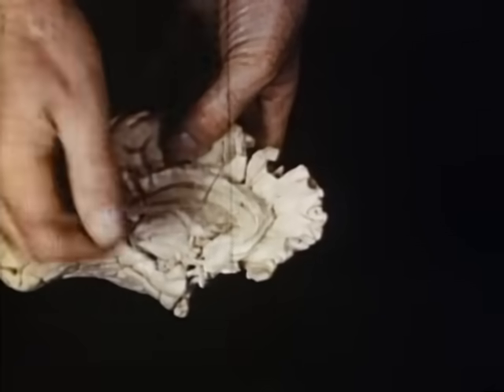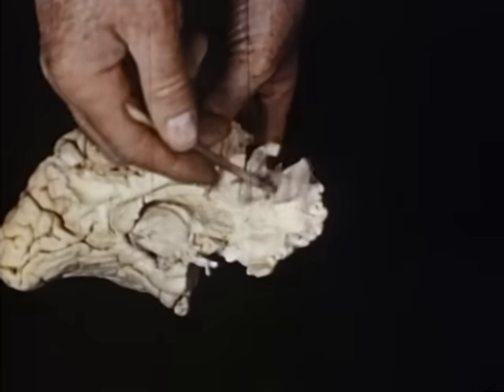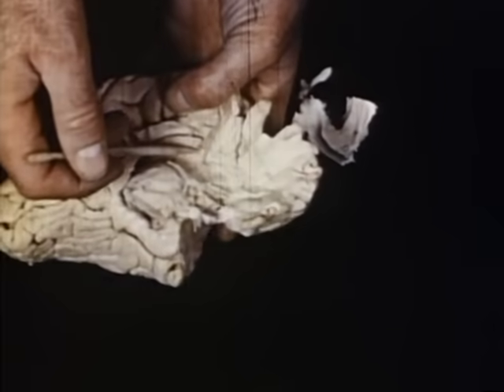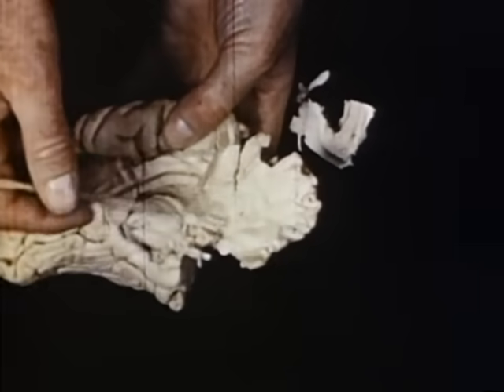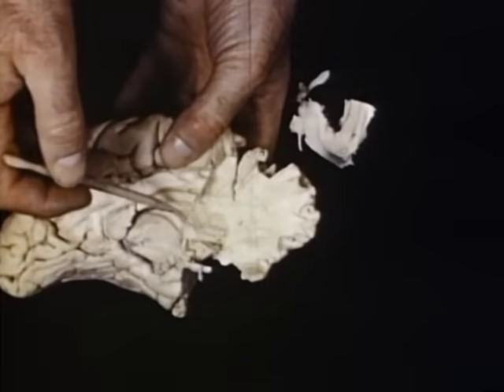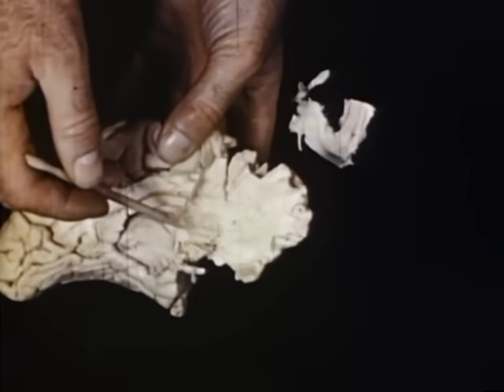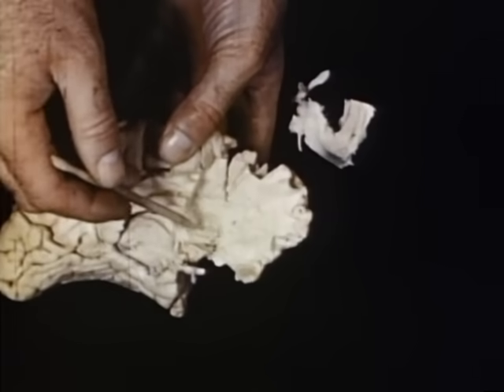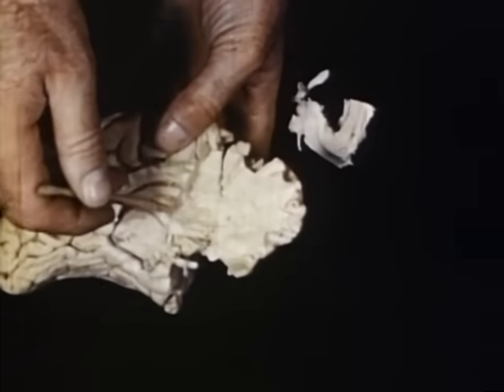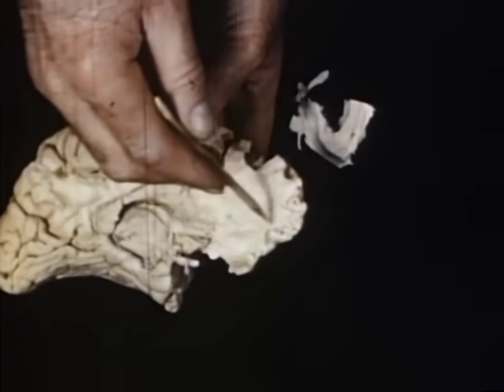The plane of the lobotomy incision lies just anterior to the head of the caudate nucleus. When the head of the caudate nucleus is removed, the fibers radiating forward from the thalamus are seen. Note the thalamus with its radiation into the temporal and the occipital regions and its anterior radiation into the frontal lobe.